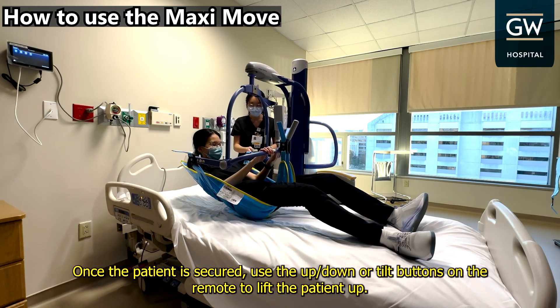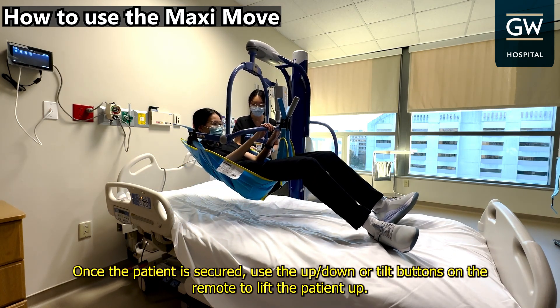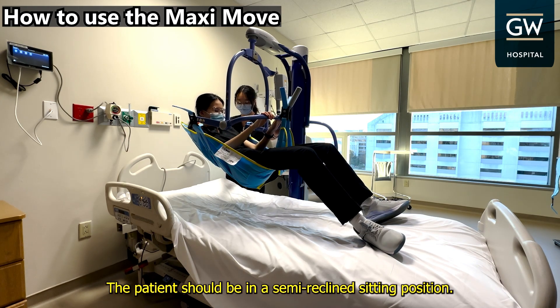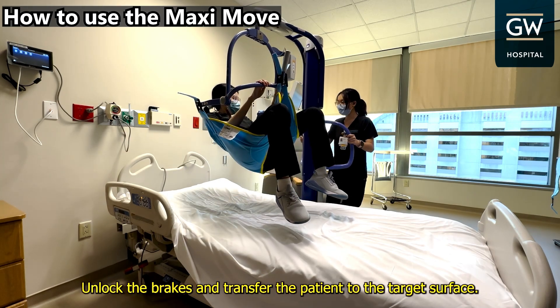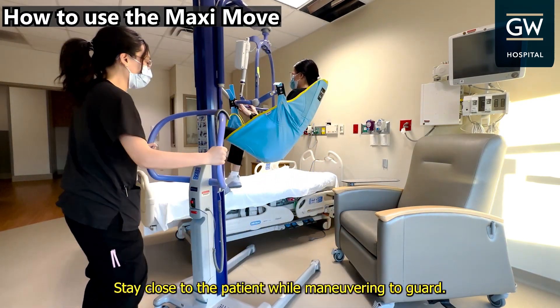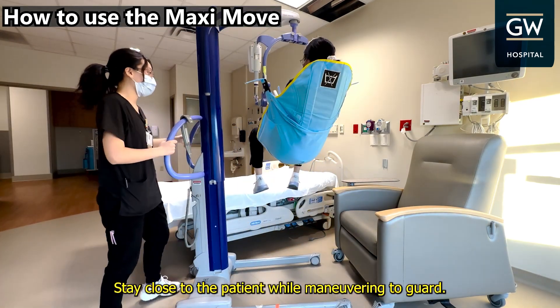Once the patient is secured, use the up, down, or tilt buttons on the remote to lift the patient up. The patient should be in a semi-reclined sitting position. Unlock the brakes and transfer the patient to the target surface. Stay close to the patient while maneuvering to guard.